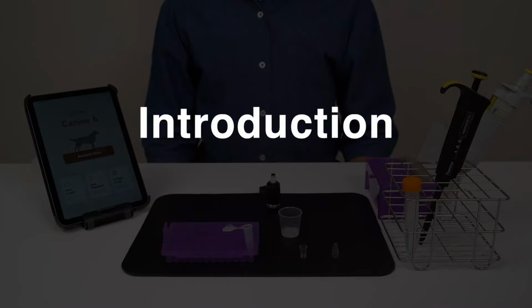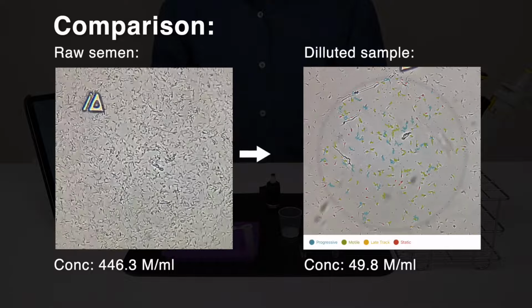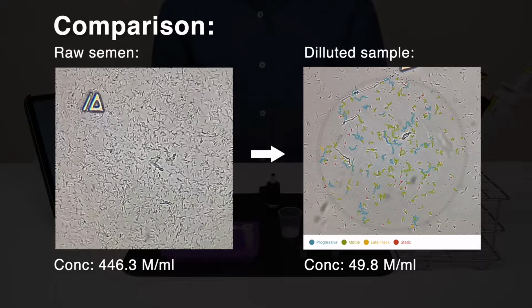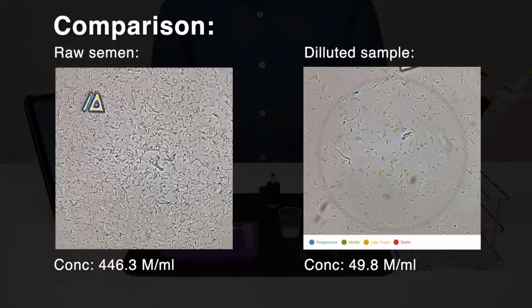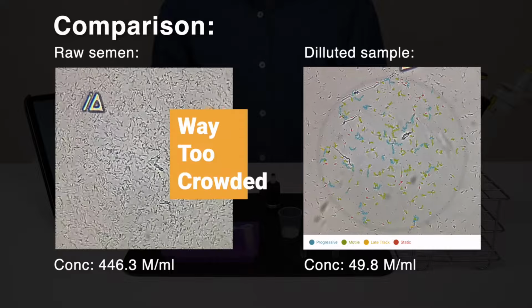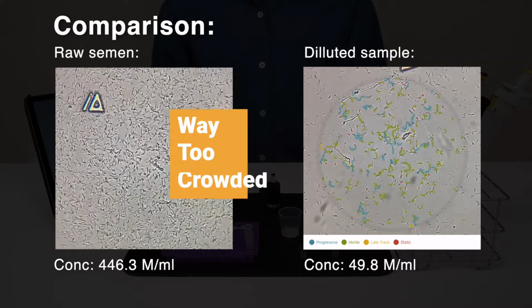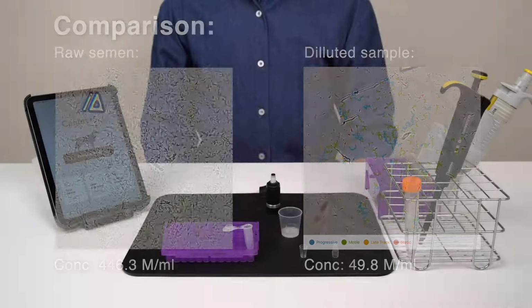You'll learn how to dilute a semen sample to the right concentration range for analyzing progressive motility with the iSperm. In order for iSperm to identify sperm motility, diluting a sample to a required concentration range is needed. As you can see, the undiluted sample on the left, compared to the right one diluted to a ratio of 1:8 with the same sample, is way too crowded for the software to distinguish the movement of the sperm tracks. That's why we must dilute it to the right concentration, that allows iSperm to analyze sperm movements correctly.